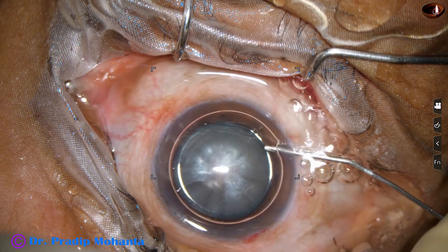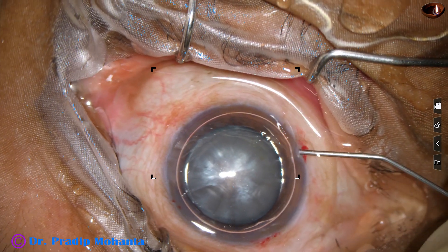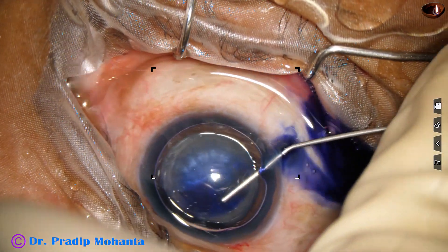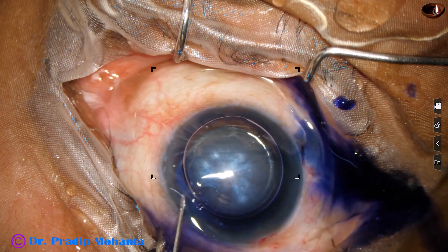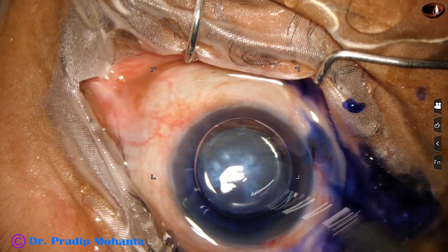I inject an air bubble through the 8 o'clock side port, and through the same side port I inject trypan blue dye. This is adrenaline. And now the dye is washed out.